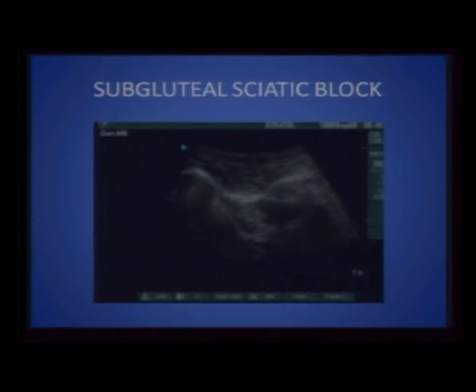In conclusion, here is a video of a sciatic subgluteal nerve block. You can see the greater trochanter, the ischial tuberosity, and the needle coming out-of-plane almost on top of the nerve. As the injection begins, you will see the local anesthetic spreading and the nerve being displaced downwards. Once the local anesthetic is placed, the nerve is actually better defined. Thank you very much.